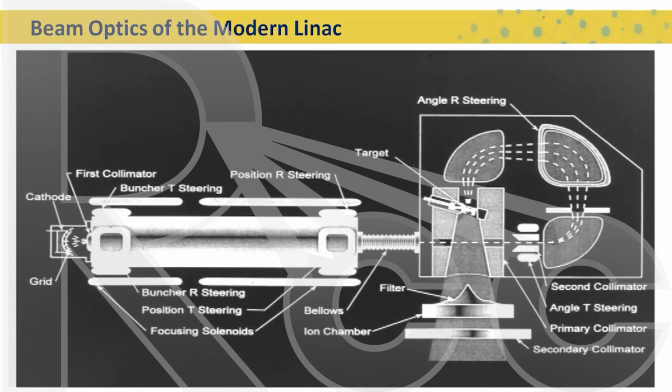So if you can model it on your treatment planning system, you can have your treatment times very, very short, like less than maybe, I don't know, 15 seconds, 10 seconds. I know the treatment times become ridiculously short for the beam on times because you've removed the flattening filter. So TrueBeam lets you do that.